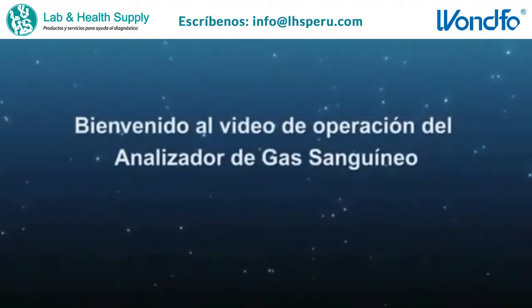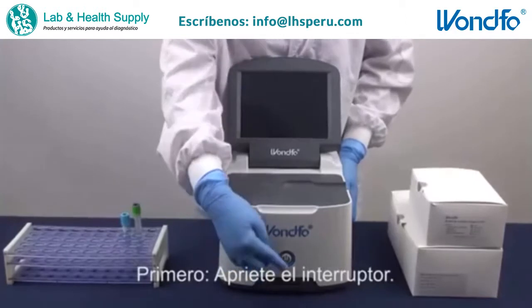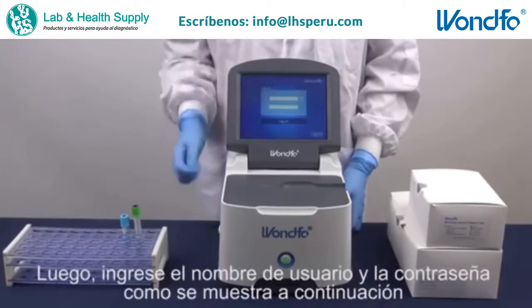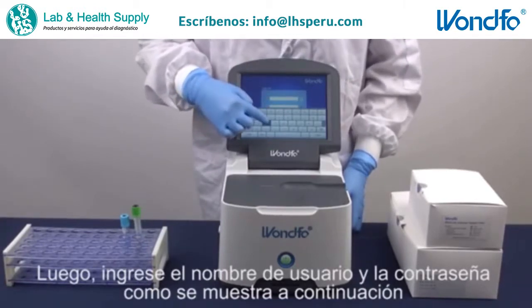Welcome to Wondfo's Blood Gas Analyzer Operation video. First, power on and turn on the switch. Then, enter the username and password as shown below.